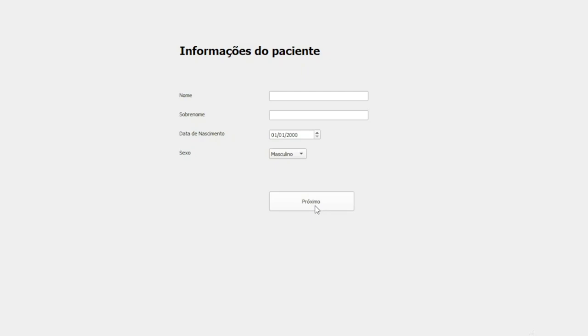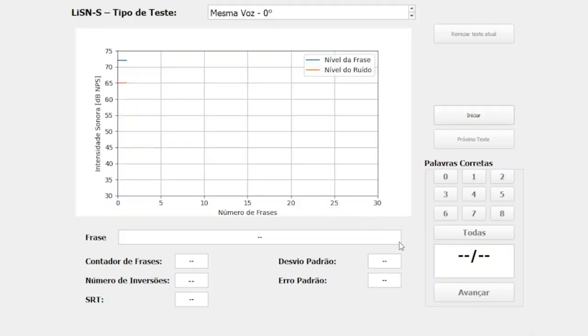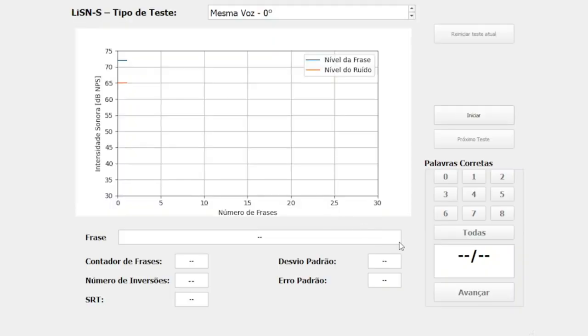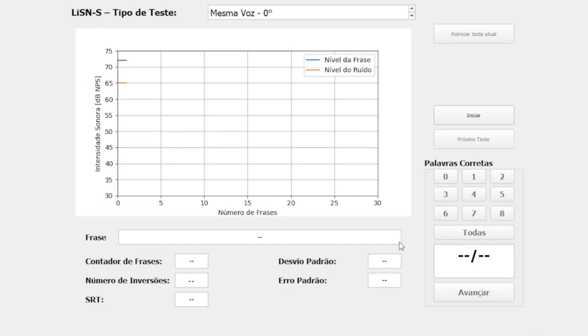Again, by clicking Next, a test tab opens. This tab displays all test information, such as test condition, sound level for target sentence and competitive stimuli, current target sentence, a number pad to enter the number of correct words, and the test statistics. The test starts when the operator clicks Start. For what follows, make sure you are wearing headphones to listen. We start with an example for the low cue condition.